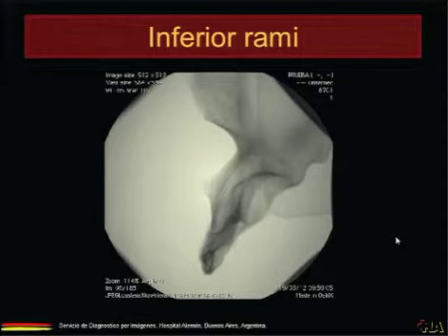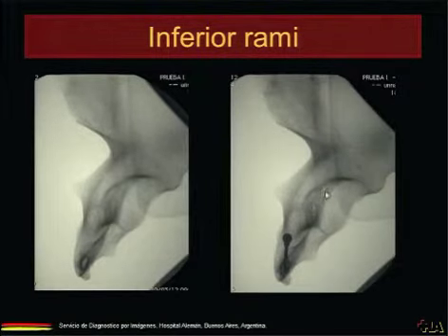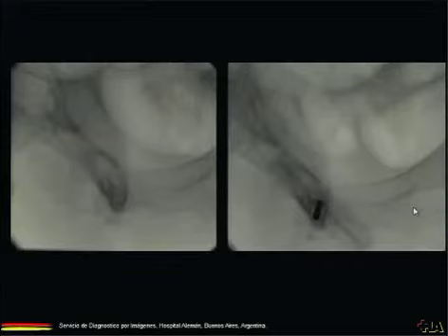And then we go all the way and have just one eye to target. Let me say, this is the needle and this is the target we go. Well, this case is easy because we don't have a femoral head and it's a very thin patient, but we have to follow the needle in different planes.